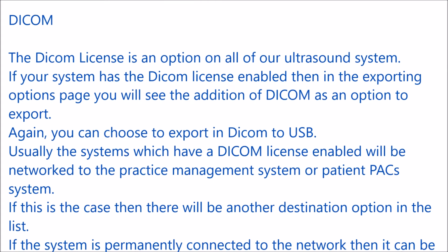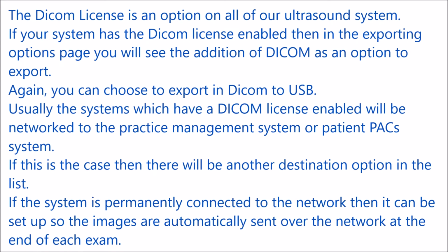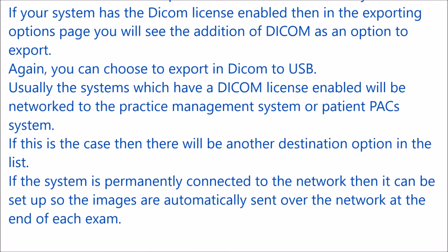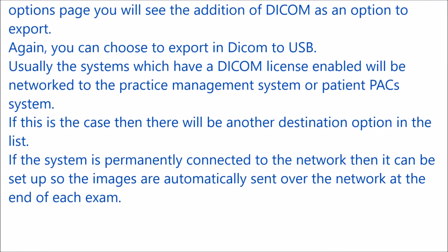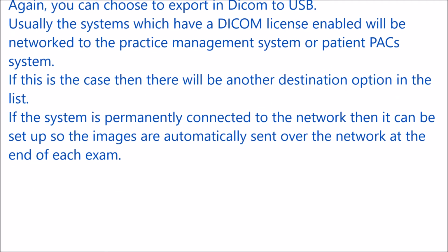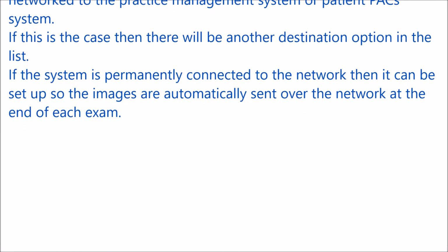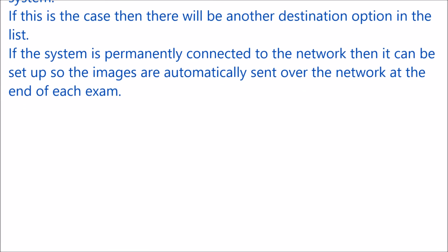Usually, systems which have a DICOM license enabled will be networked to the practice management system or patient's PACS system. If this is the case, then there will be another destination option in the list. If the system is permanently connected to the network, then it can be set up so the images are automatically sent over the network at the end of each exam.